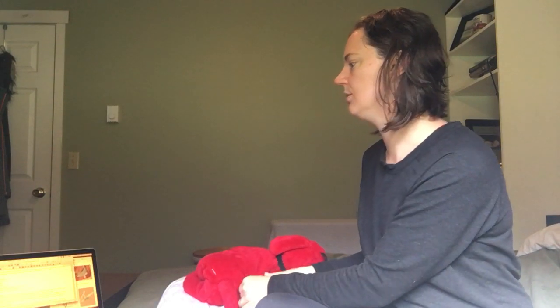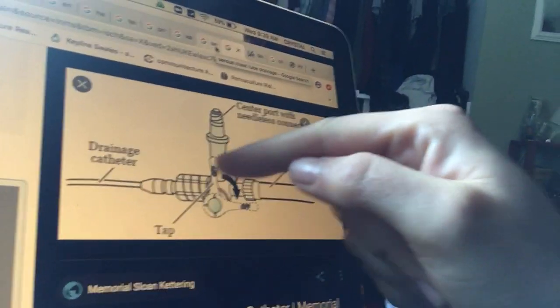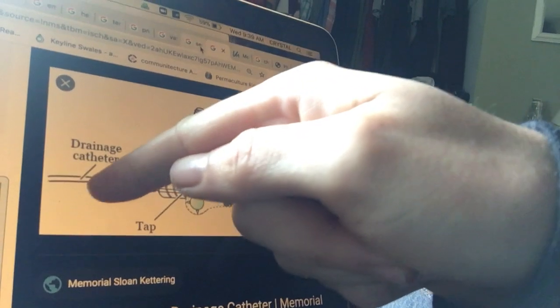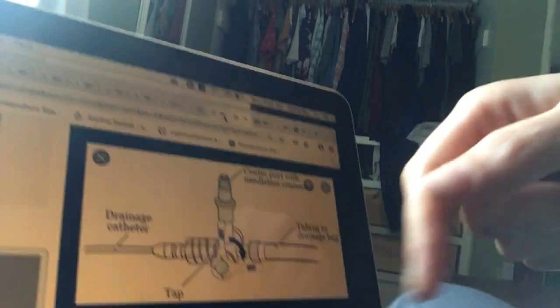It's not providing any of that suction to the patient that helps keep their lung inflated, so it needs to not be kinked. You want to look at the stopcock on the tube if it has a stopcock. There's often a 3-way stopcock on the tube. I've got a picture of one here to show you. And you just want to make sure that it is open to the patient. So you want the stopcock to be off toward the 3rd port that way, and you want to make sure that the fluid can run from this tube down and out this bigger tube here.